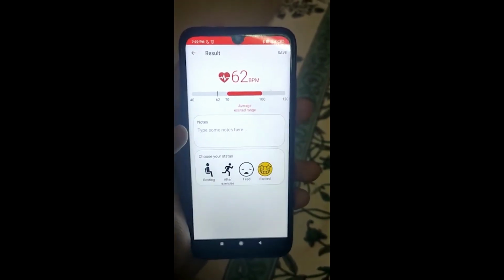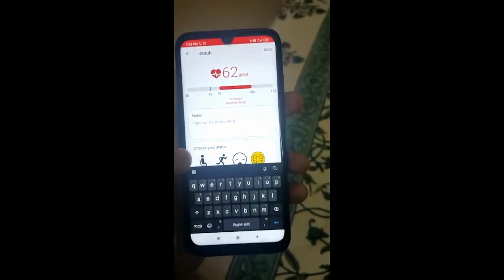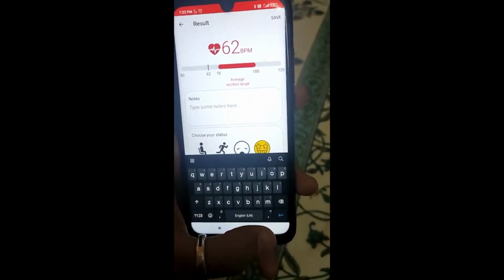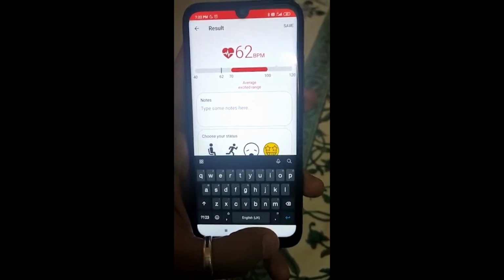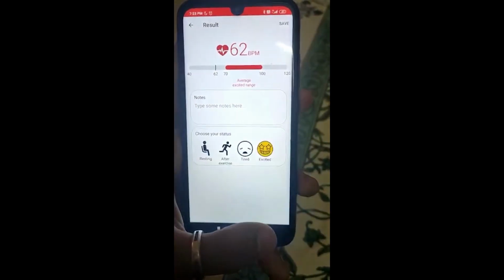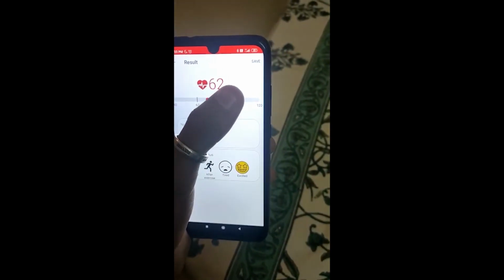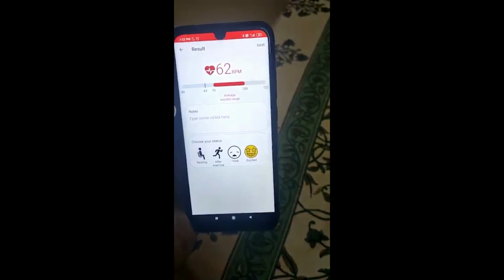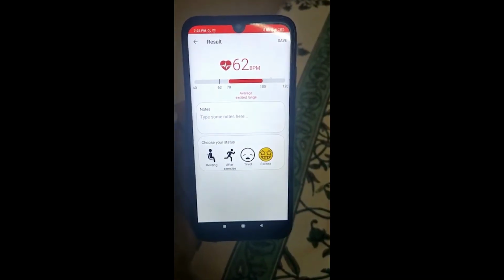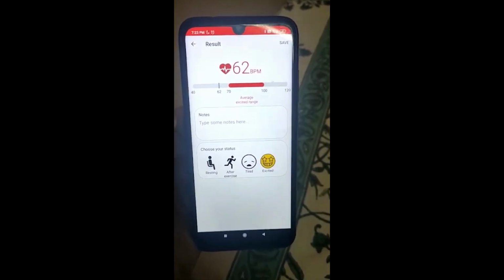Now we have also added a notes layout here, in which we can type something, or we can keep a note of what we have done, or for how many hours or minutes we have done the exercise, and we have calculated the heart rate and much more. Here is the save button which we can see at the top, and if we click on it, we'll see another range or graphs which tell us the differences between the previous results and also today's result.